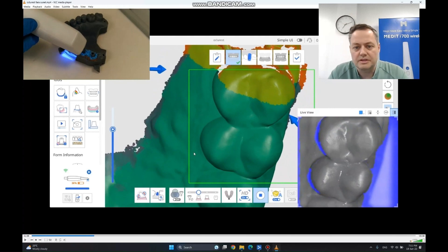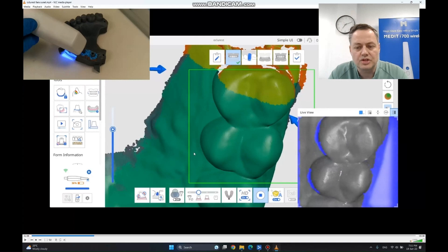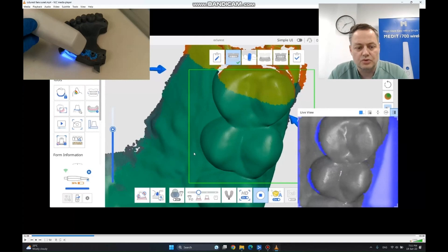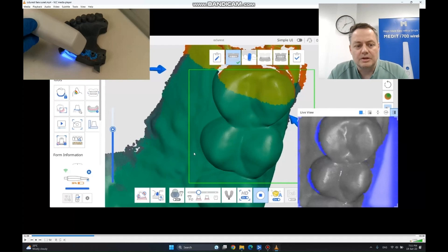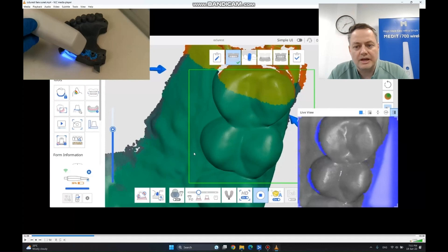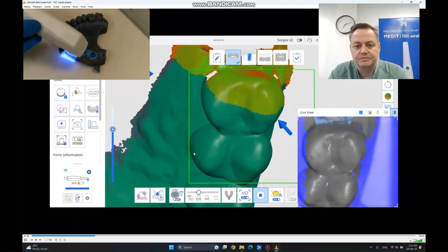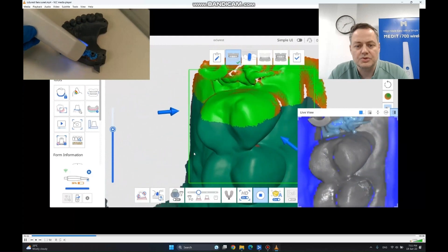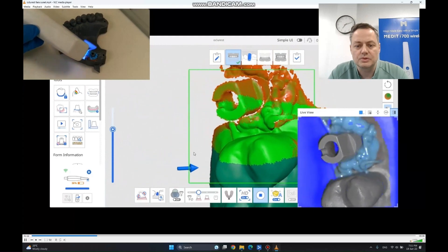Because at this stage we already saw how to impression the full arch, we are just going to go forward from the point we already took an impression of the arch and just add data in HD with the scan bodies, as you previously saw.